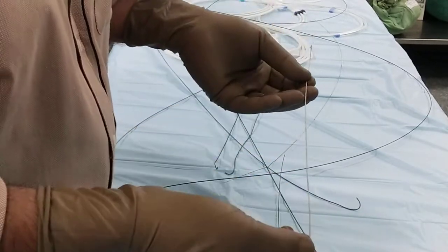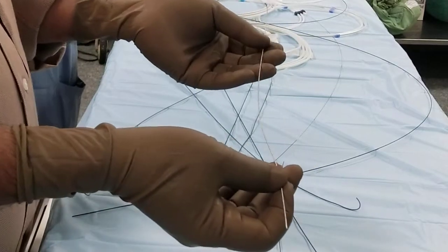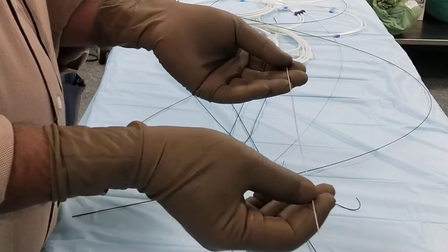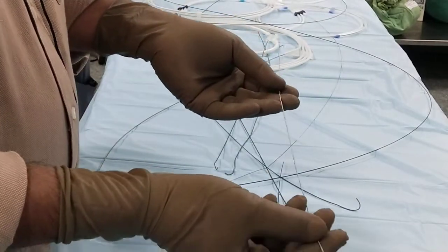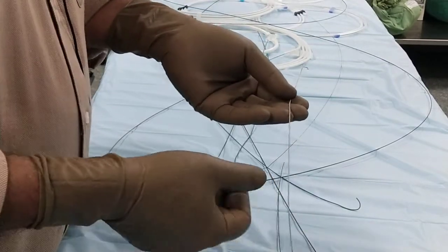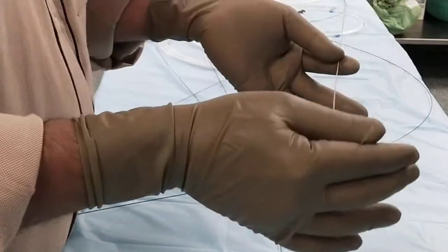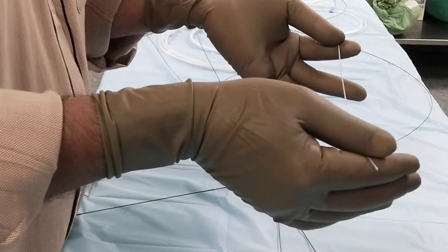You will always find the femoral artery first, because it is the easiest and we can handle it very well. If there is a complication, we can handle it. Femoral access is the first choice, always the first choice. But nowadays, people want to get in and out of the hospital as soon as possible.